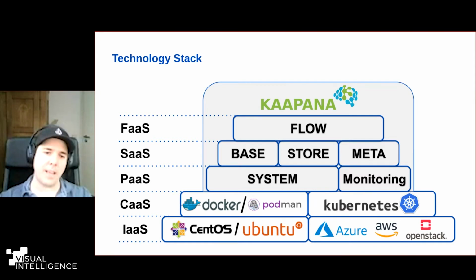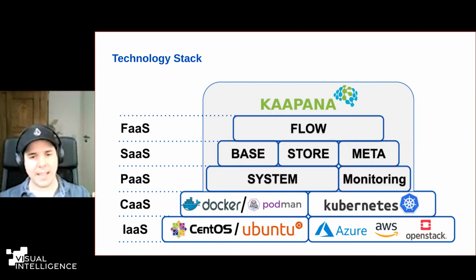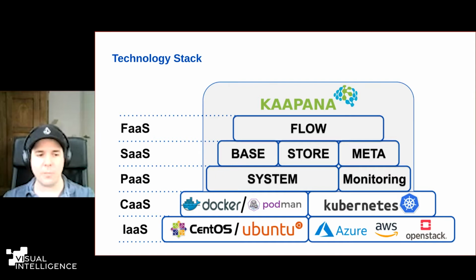And then on top of that, there's a layer of containers. Usually we use Docker containers or some similar system. And this is also a main theme through the platform. Everything is a container. So every service is a container, every web interface is a container, but also every processing step. So if you do, for example, a PyTorch training, that will also run in a container. And the big benefit here is that it scales very well. We can easily switch out components. We can easily update single things. So it's actually a very neat technology.